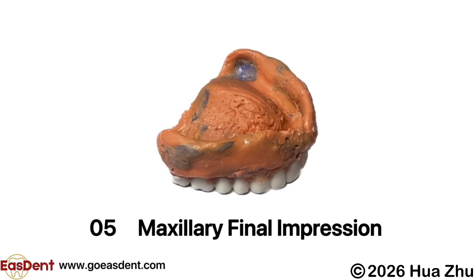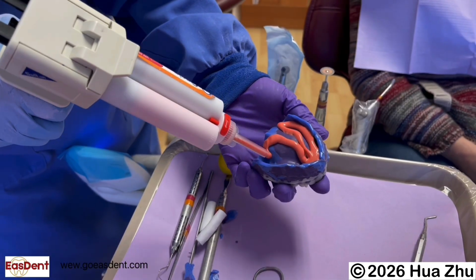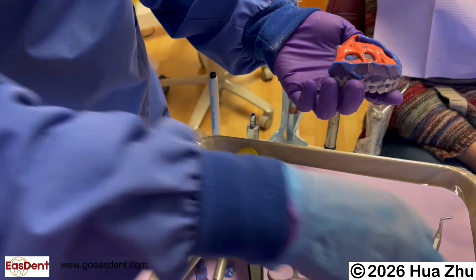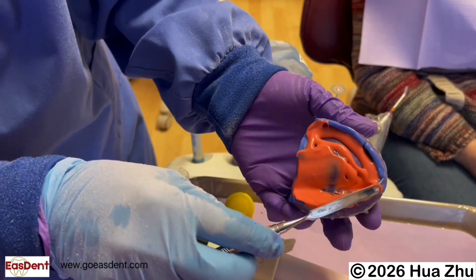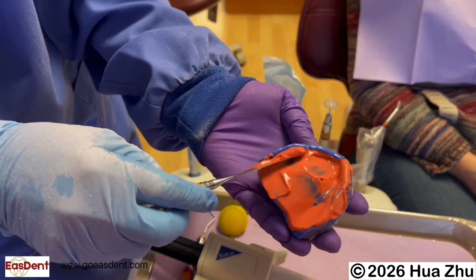Maxillary final impression. Put a thin layer of regular set light body PVS impression material on the tissue side of the tray. Use a mixing spatula to apply the material to cover the tray evenly. Make sure the border is also covered. Do not put too much material. It may gag the patient.